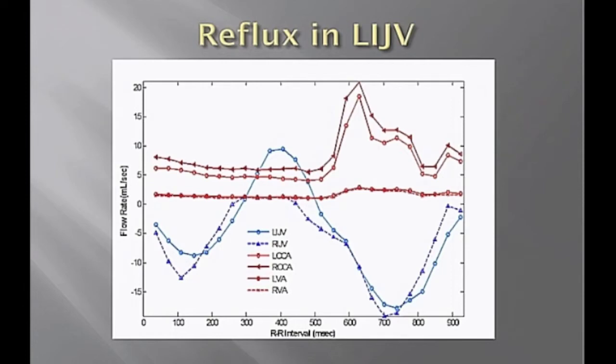But the nice thing about this is you can measure this on every patient. This only takes a few minutes. It's between 1.5 and 3 minutes, depending on the heart rate of the individual.